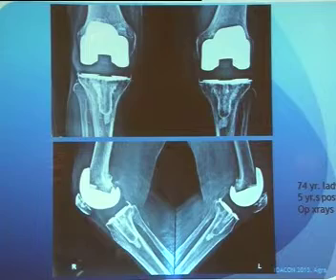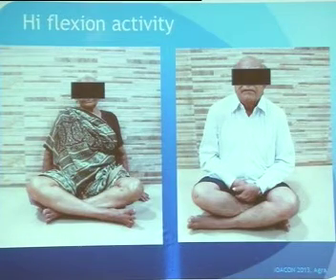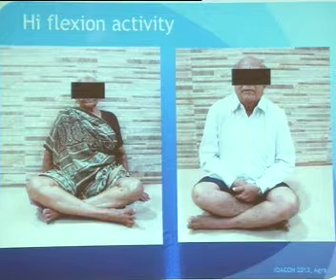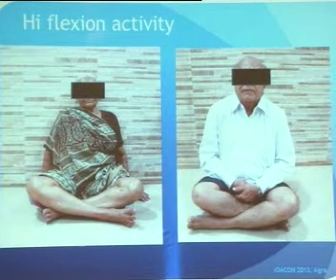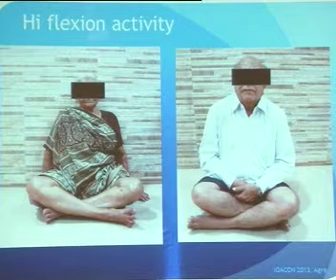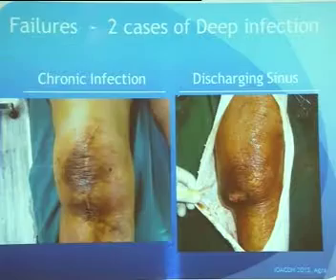Now, these patients also, depending on their functional demand, can perform high flexion activities. So this again proves the point that the flexion one gets post-operatively depends on the pre-op flexion. Obviously, what we do surgically also matters, what soft tissue release and what bone cuts we've made. But even with a fixed bearing implant like all poly, if the patient is able to do this, they sometimes do in our social and religious setup.